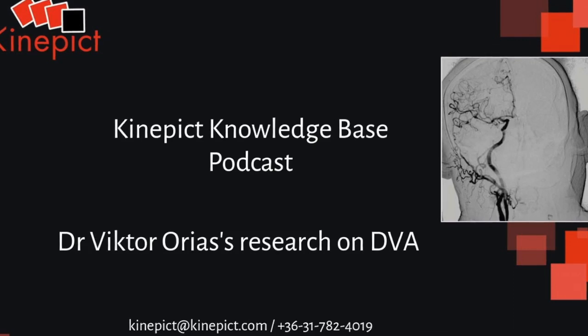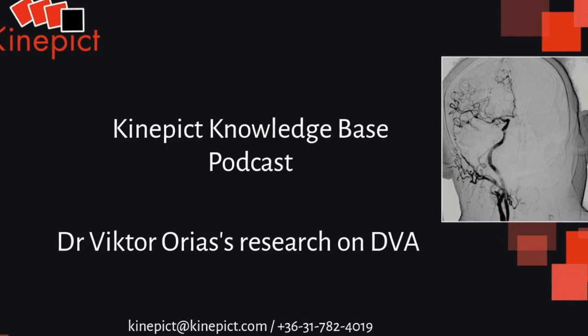Results have shown the DVA provided similar contrast to noise ratio improvement regardless of the image acquisition protocol and instrument. Therefore, we concluded that the image quality enhancement is independent of these factors. The subjective comparison of the images showed that the evaluators prefer DVA images in all regions. Evaluators judged the DVA images better in a convincing 85% of all image pairs. And the overall inter-rater agreement was 89% and highly significant.